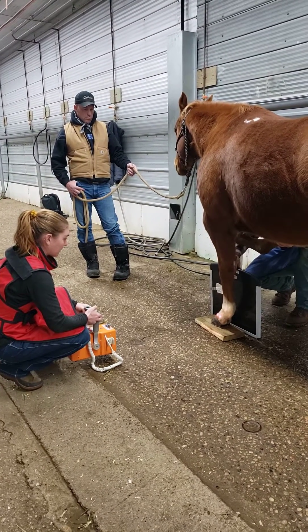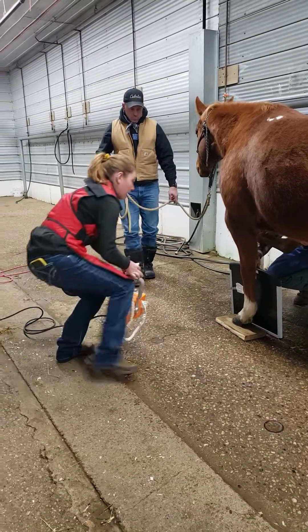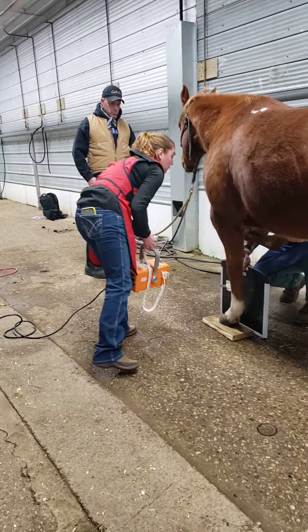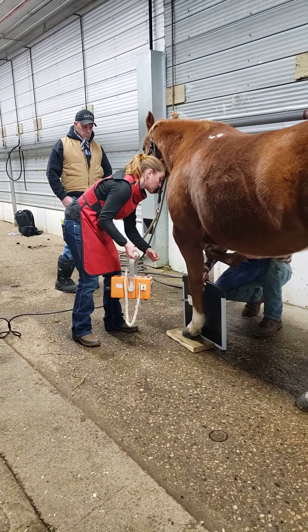We're going to take the back of the plate towards me. Our plate is nice and straight — bring it right up against the block.